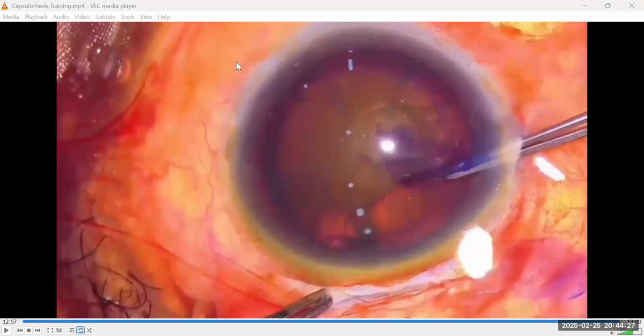Question is, how calcified? If the calcification is localized, then you can shear it out with a centripetal force. If the calcification is going to compromise the integrity of the capsule, I will introduce micro scissors and shear it out from there with the scissors.